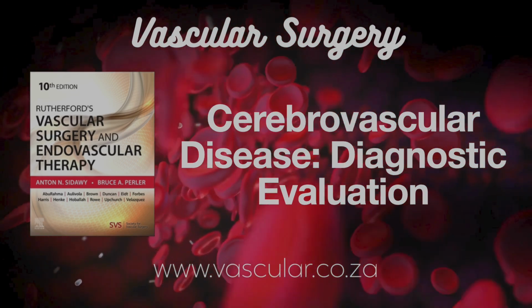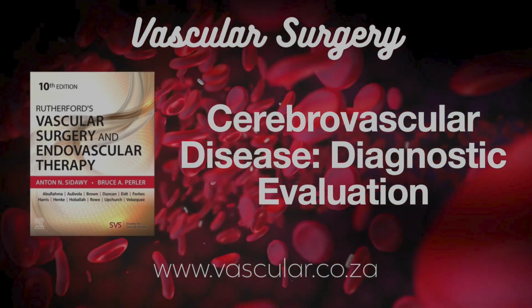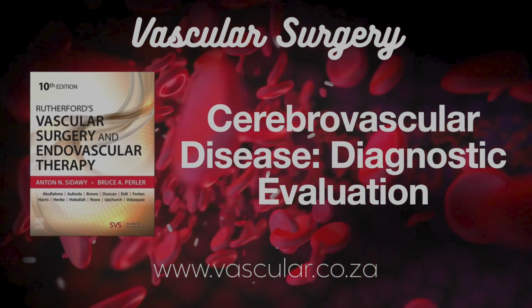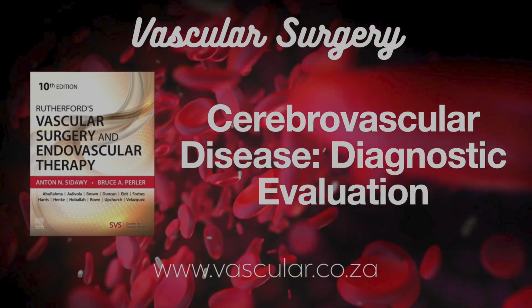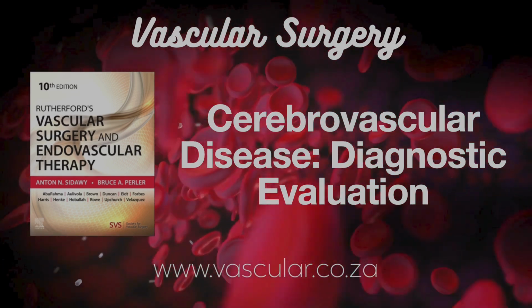The positive results from trials like ROADSTER and the big TCAR surveillance project really rely on this careful, imaging-guided patient selection. So CTA is key for both types of stenting, but looking for slightly different crucial details depending on the approach. What about trauma? You touched on this earlier. Right. For injuries in zone 2, the middle part of the neck, DU can be a good screening tool and useful for follow-up if you're watching a minor injury.